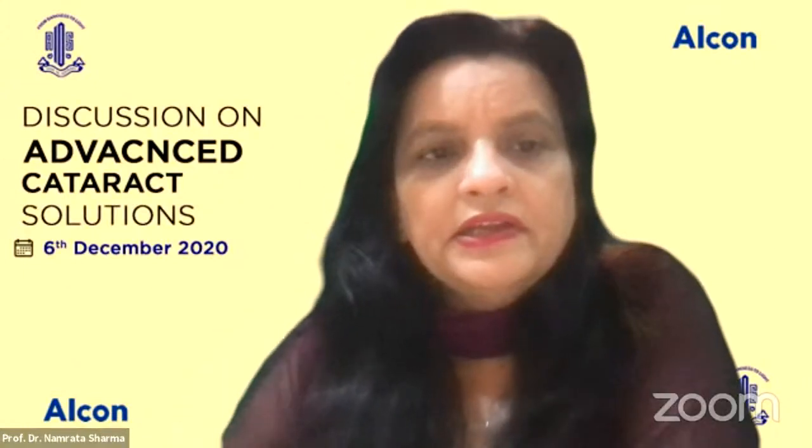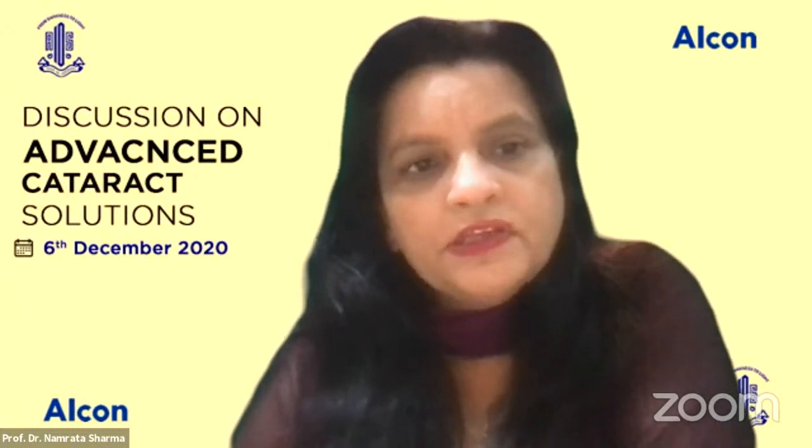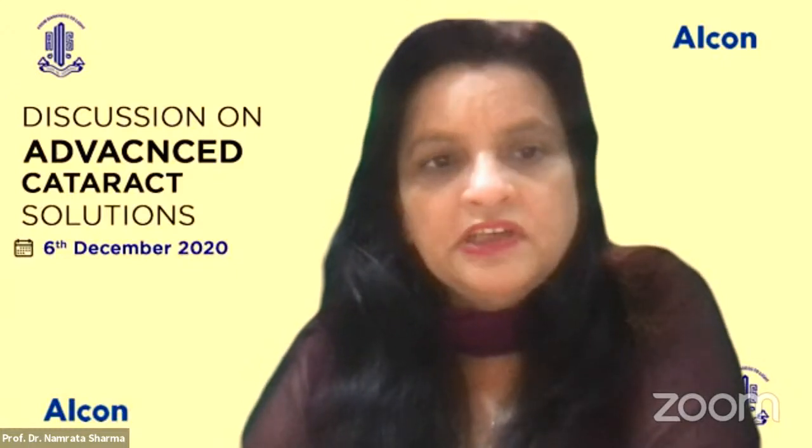We did do a study of stereo acuity, not only for panoptics but also for EDOF lenses like Symphony intraocular lenses. And we found that when you compare it with the other multifocal lenses, the stereo acuity was far better.